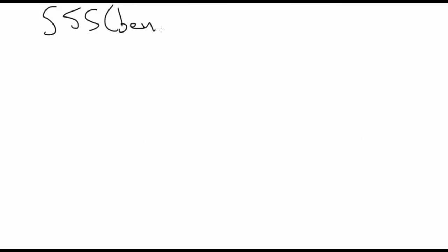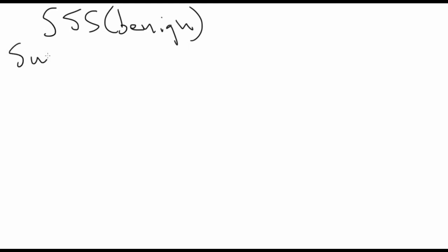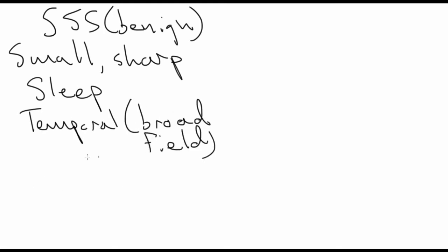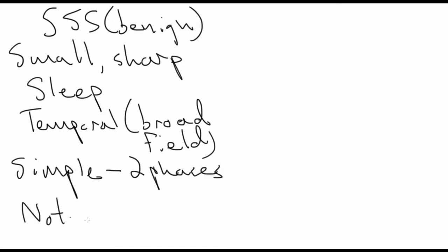Small sharp spikes, a benign variant, can be distinguished from focal epileptiform discharges in many ways. As mentioned earlier, they are small and sharp. They occur during sleep. They are usually maximal in the temporal region, but can have a very broad field. They usually have a simple morphology, often with only two phases. And most importantly, they are not associated with epilepsy.